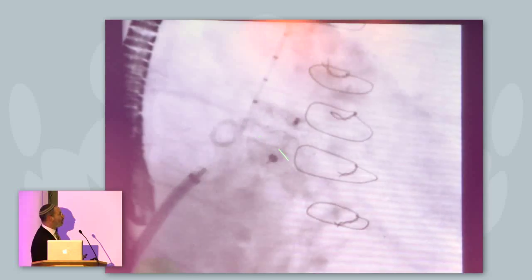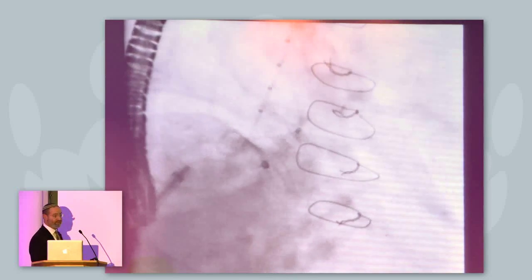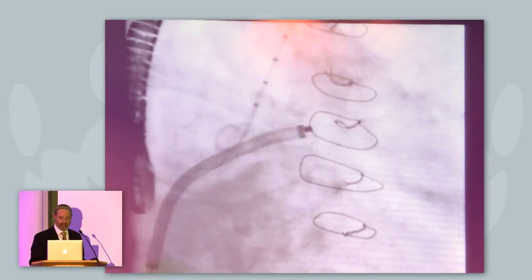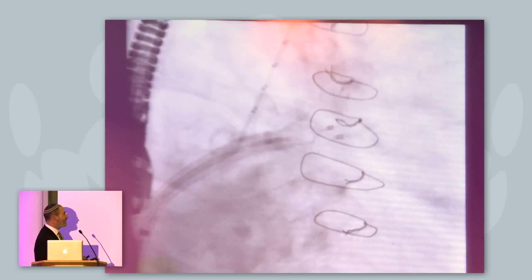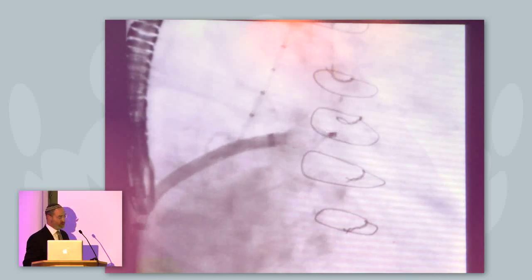And here it was very helpful because it allowed me to see what the position of the disc in the final position is going to be. And clearly it's not adequate. It's still open here. So therefore, I was unhappy, and I actually changed and upsized the device. So at this point, I had enough trouble beforehand, and as you can see now, I'm actually dealing with an even bigger device that's coming out in a longer fashion.